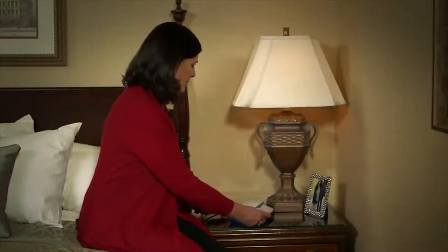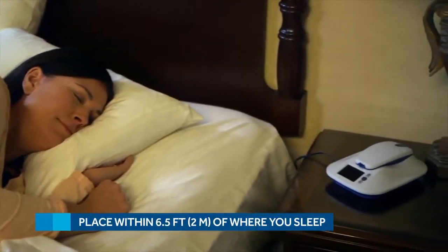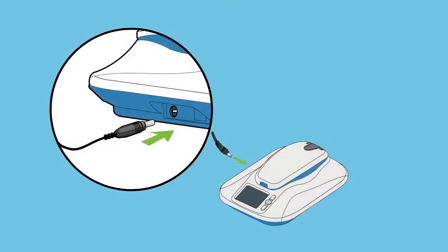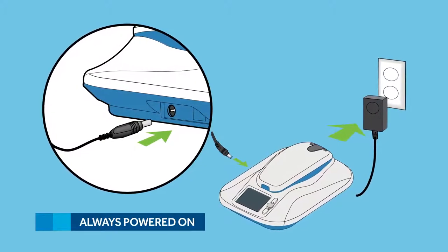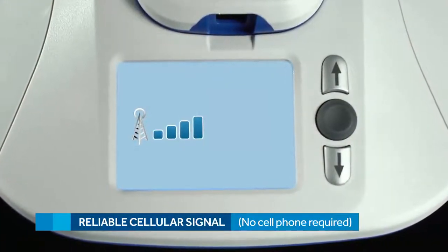First, find a good place to keep the MyCareLink monitor. It should be placed within six and a half feet, or two meters, of your bed. This is because your doctor will program your Reveal LINQ device to send information to the MyCareLink monitor at a time you're usually sleeping. Plug it into a standard power outlet and make sure it's one that receives constant power — avoid an outlet controlled by a wall switch since it could accidentally get turned off. Also make sure the location you choose receives an adequate cellular signal. A bedside table like this one should work perfectly.